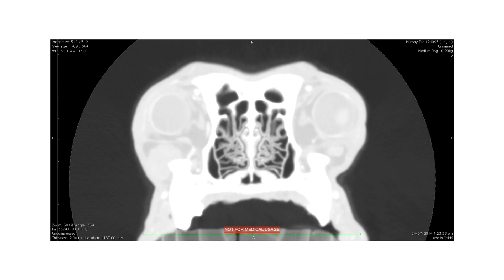With respect to sample images, because we have a CT scanner at our practice and not an MRI, I'm going to concentrate on CT to demonstrate some of the capabilities. This is a nasal scan and we can see that we can visualize the nasal turbinates really nicely. And if you do the volume scans, which are scanned at half a millimeter in all dimensions, you can re-slice this in either a coronal or a sagittal plane and get really, really good spatial realization in three dimensions.